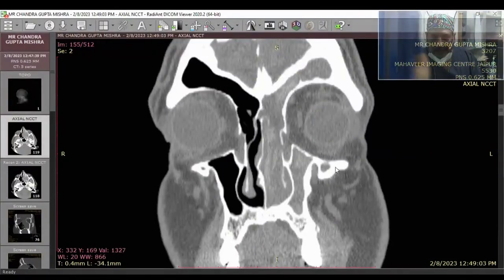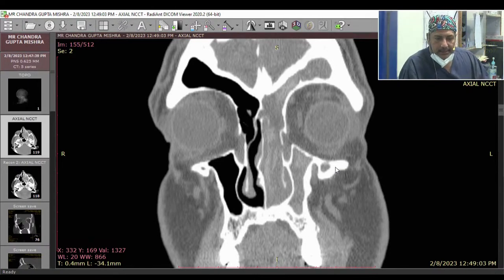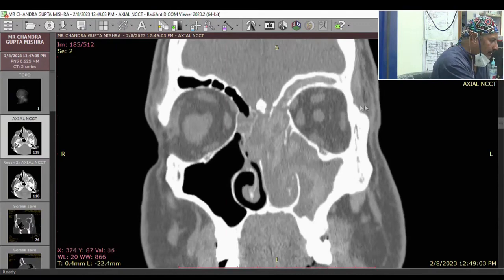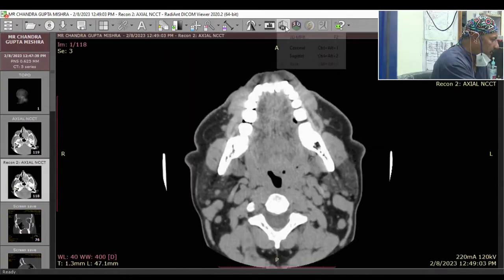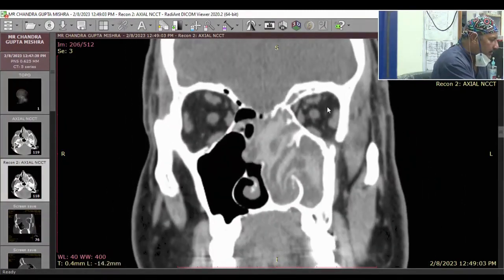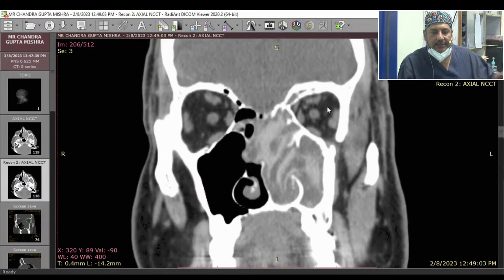So this particular patient, we have discussed in the morning about understanding this disease at the molecular level till the concept and decision making, and then various endotypes. So this first case starts with an interesting endotype. This is a case of allergic fungal rhinosinusitis. And what we discussed in the afternoon, allergic fungal sinusitis presents distinctly with certain classical features on radiology as well. Can you see something?